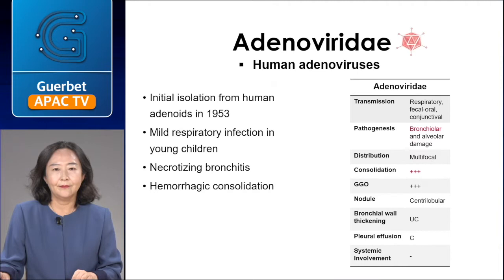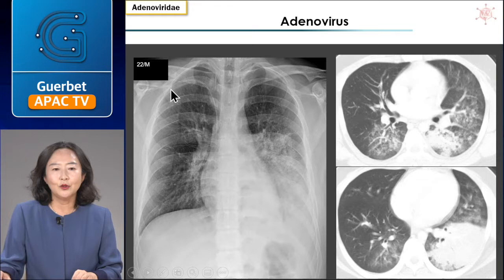Adenoviridae: bronchiolar and alveolar damage results from necrotizing bronchitis and hemorrhagic consolidation. Typical imaging findings include consolidation and ground-glass opacity. This is a case of adenovirus pneumonia in a 22-year-old immunocompetent man. Multifocal consolidations and ground-glass opacity along the bronchovascular bundle are noted.